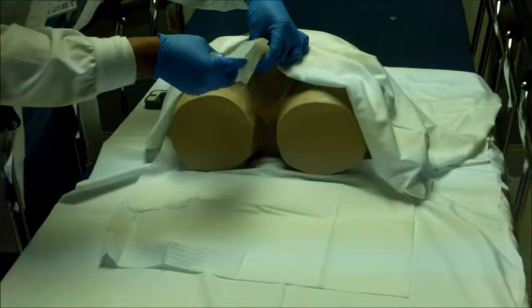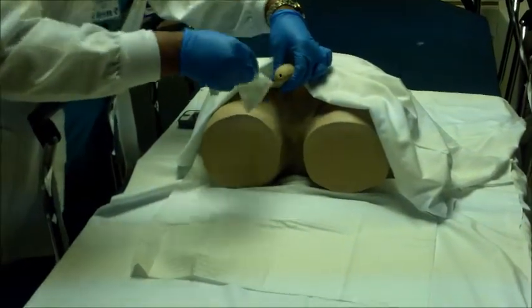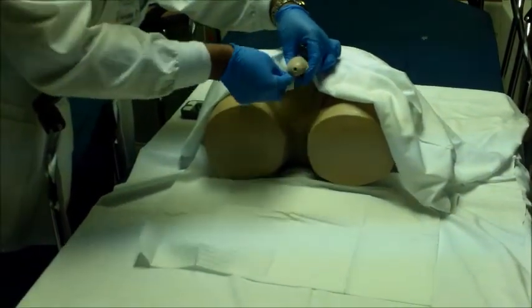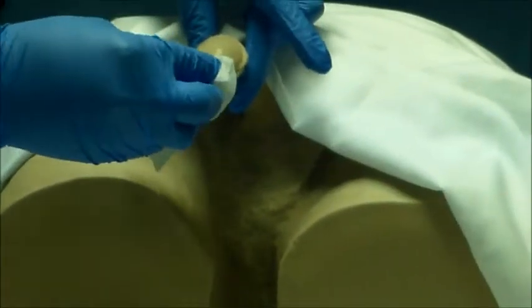I want to take his penis. I'm going to start with the inner and work myself outer using a ring. Start here. Last one.